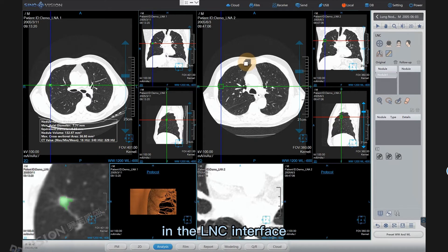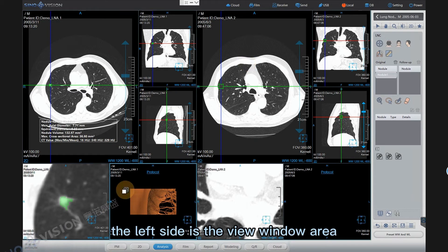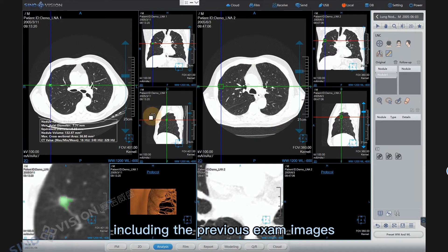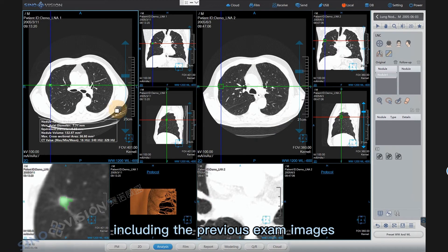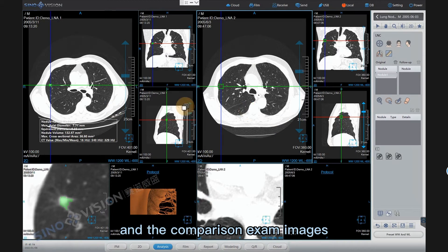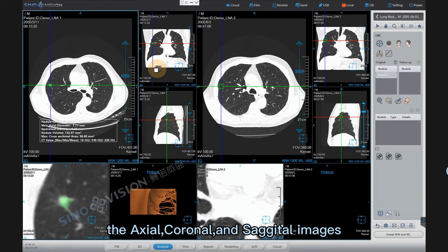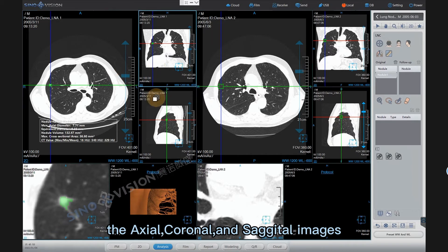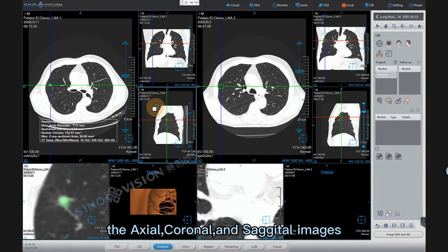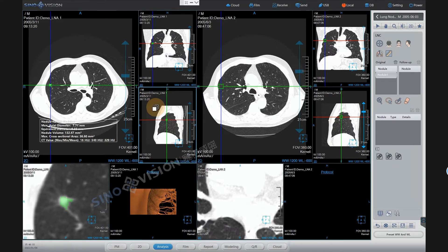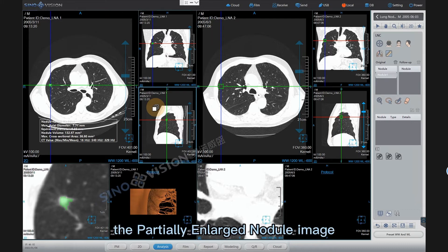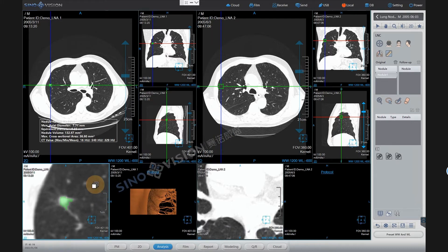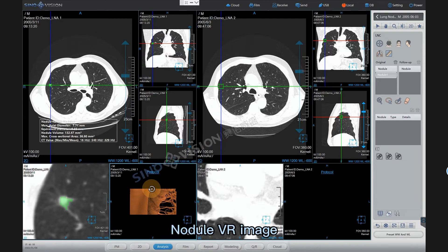In the LNC interface, the left side is the view window area, including the previous exam images and the comparison exam images. The axial, coronal, and sagittal images, the partially enlarged nodule image, and the nodule VR image are displayed here.